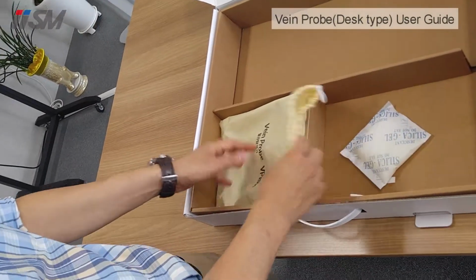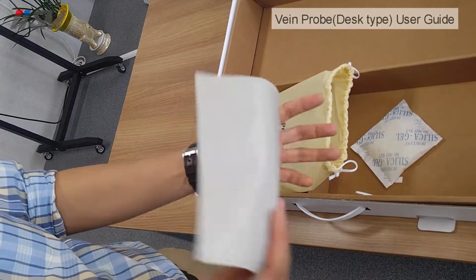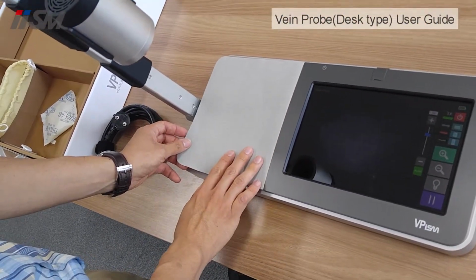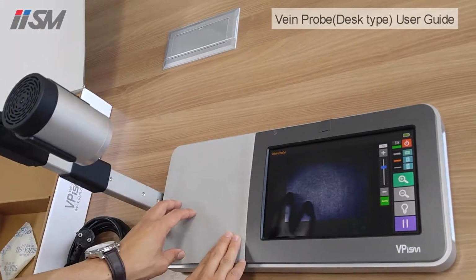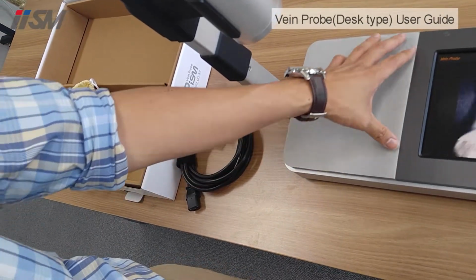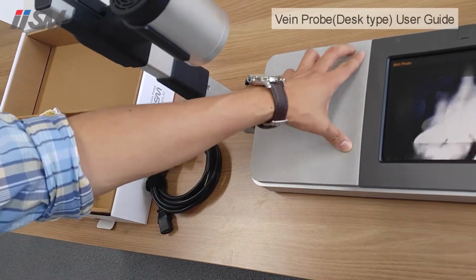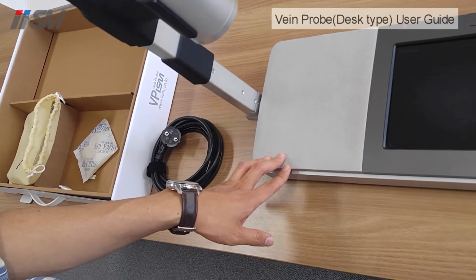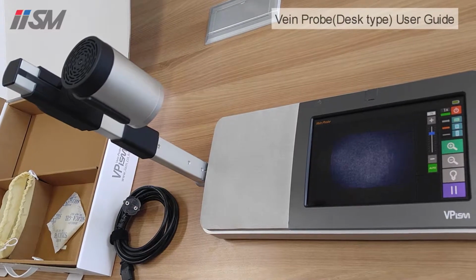Okay, and then also here's the hygienic pad. You can put it here before use to keep the device clean from any contamination or any kind of dirty stuff. And if this hygienic pad becomes dirty, then you can change it to a new one.